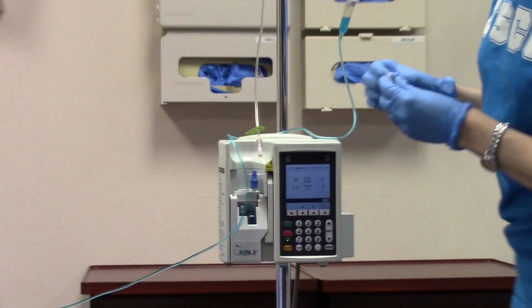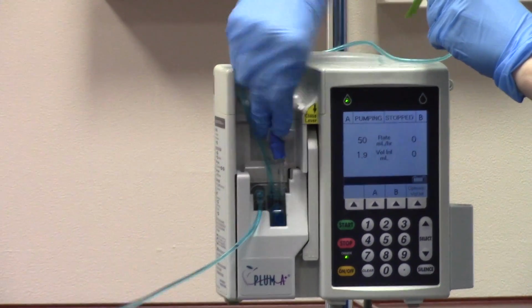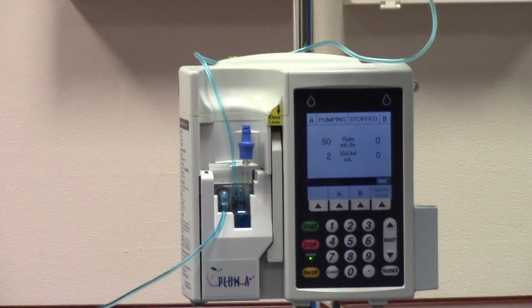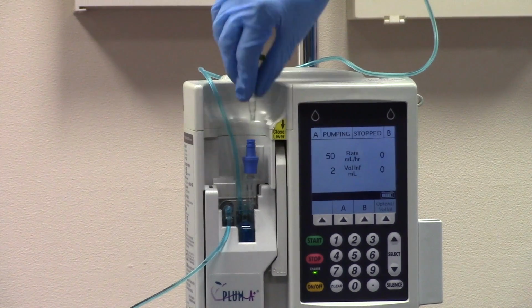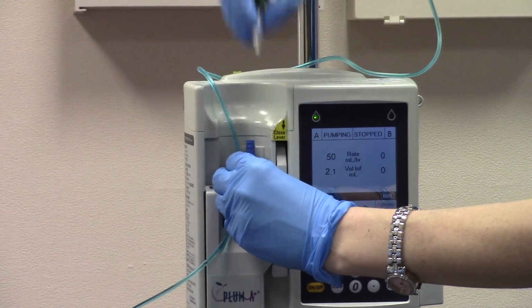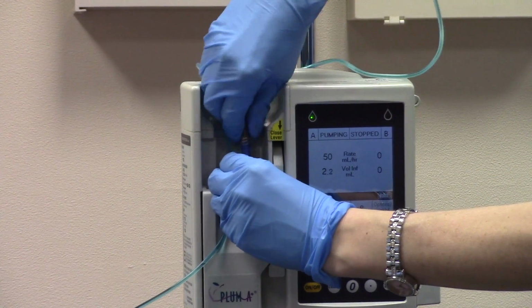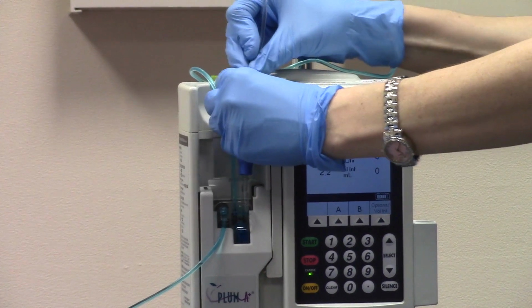I do have to clean with alcohol. Remove the cap. This is a luer lock, so you push and there's the screw top, so push and twist. And I need to unclamp.